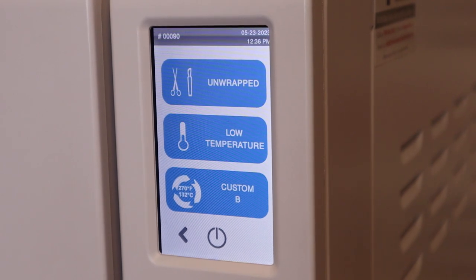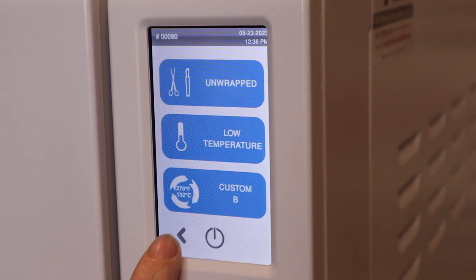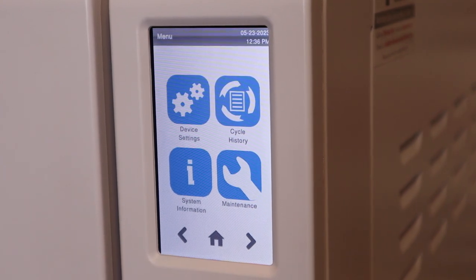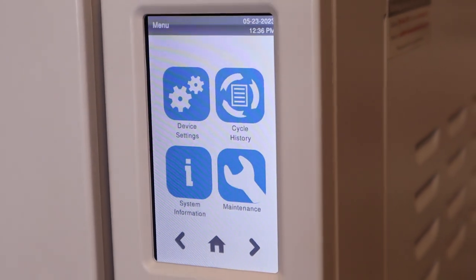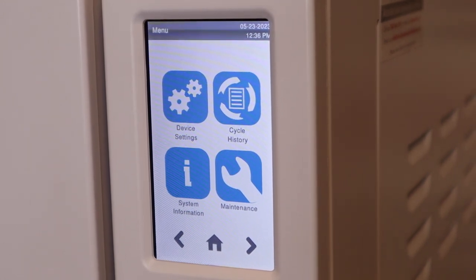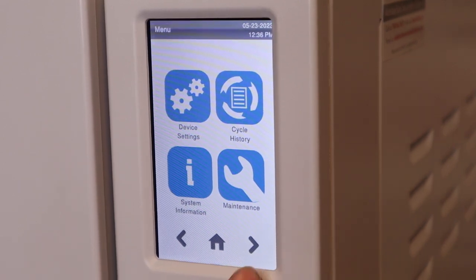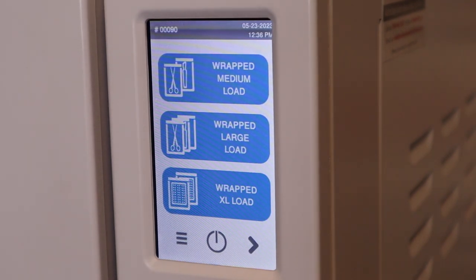So if you're having to do things that have to be FDA cleared, do not use the custom B cycle. From there, we're going to navigate to kind of our device menu. Here we can see device settings, cycle history if you do have to go back and ever look at previous cycles. You can also see system information, which contains your serial number and other software versions. Your maintenance menu is also right here, which you'll receive notifications for. Traceability options will be found on the next page if you do need traceability in your practice. And from here, we can click the home button, which takes us back to our initial screen on standby mode.